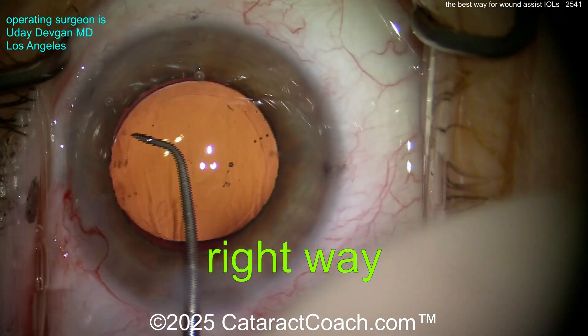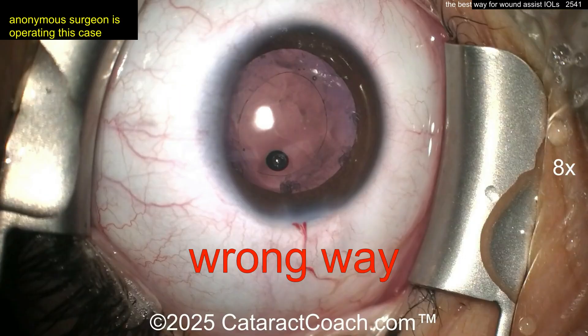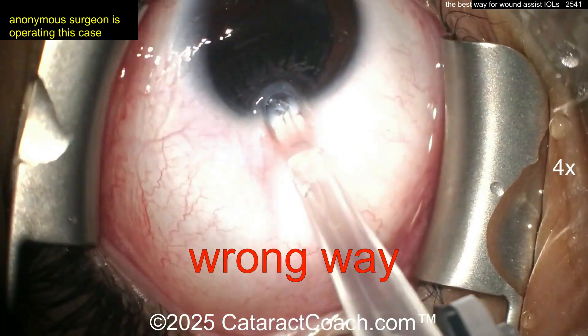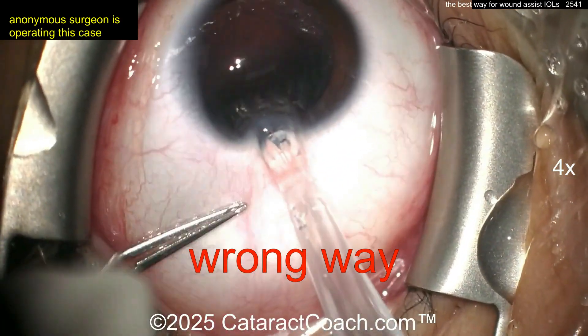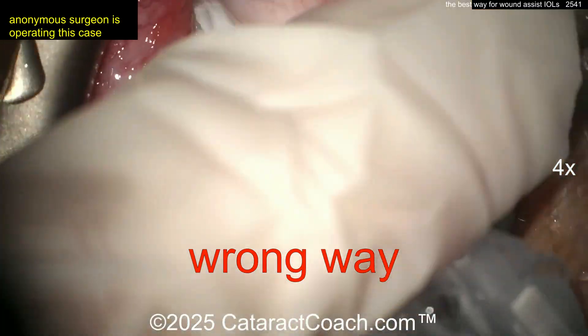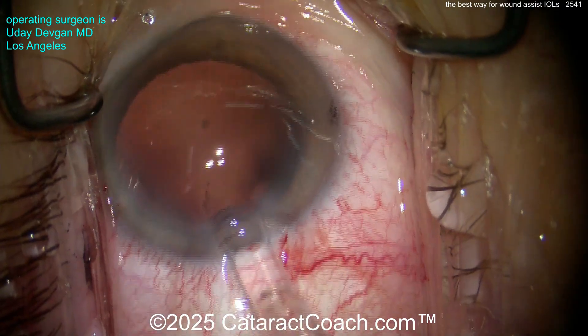Now let me contrast that with the wrong way. Here's the wrong way: the eye is in the nasal canthus and you're just shoving the lens in. This is not the way you want to do it. You lose your view. In this case, this is a video we had previously where the incision is too small and you're trying to shove it in the eye.